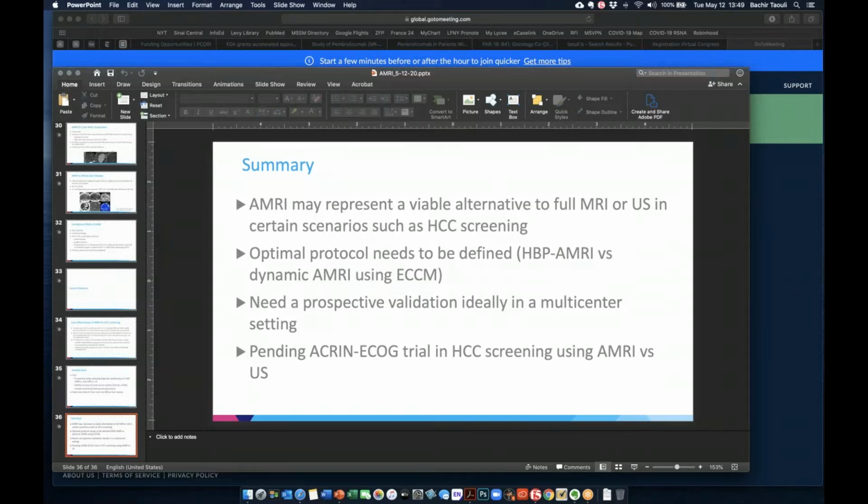Yeah, I think overall most of the LI-RADS lexicon is based on dynamic imaging, right? But if you just do dynamic T1 for HCC diagnosis, I think it's okay. However, you'd be missing some ancillary features. You have to remember the ancillary features on diffusion or on the delayed hepatobiliary phase. So you'd be limiting yourself only to dynamic imaging, which is most of the time okay, but that additional percentage of cases where you may diagnose a LI-RADS 4, for instance, would be missed. But I'm really talking only about screening here. For diagnosis, it's a different story. Okay. All right. Thank you very much.